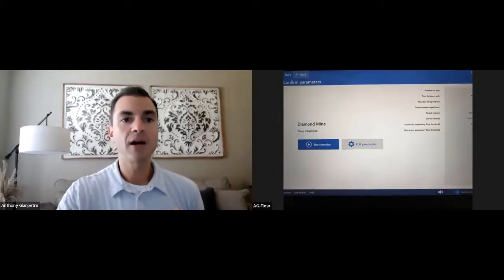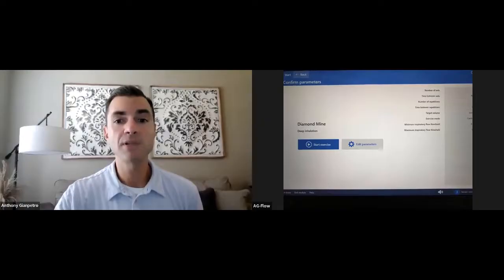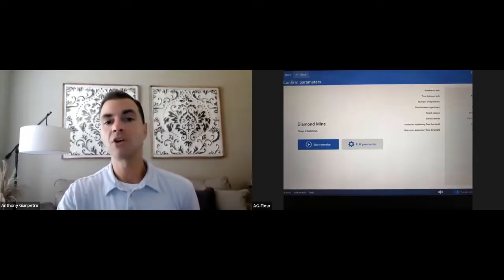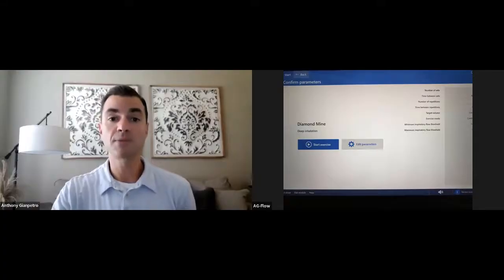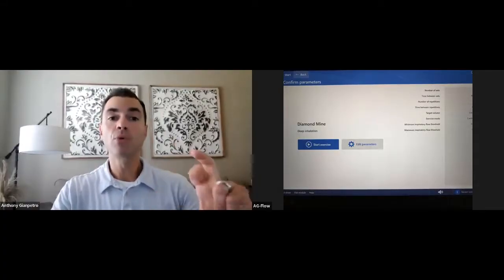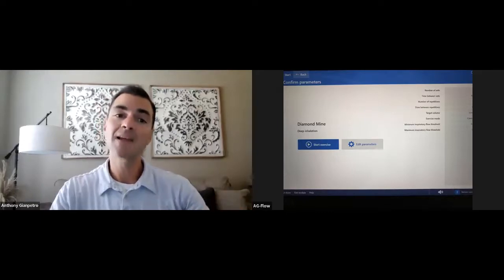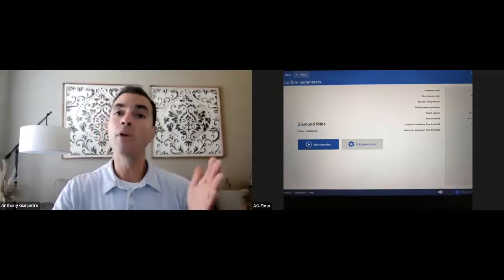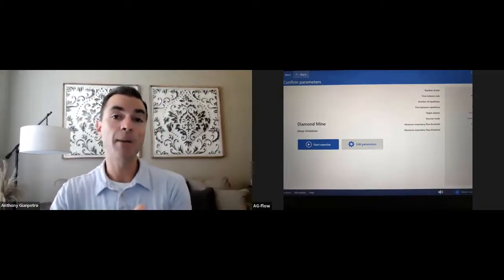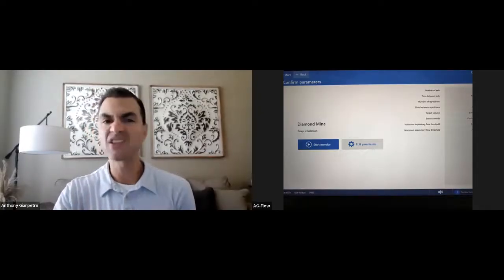And just to take you through, let me go back to the slide presentation so you can understand how this presentation, which should have been sent to you, is sped up. We will go through all of these specifics with you. You can see some nice slides that point out everything I was telling you about with the sets and reps, the target volume, volume only versus the next step of exceeding minimal threshold, and the final step of controlling flow, what that's all about.